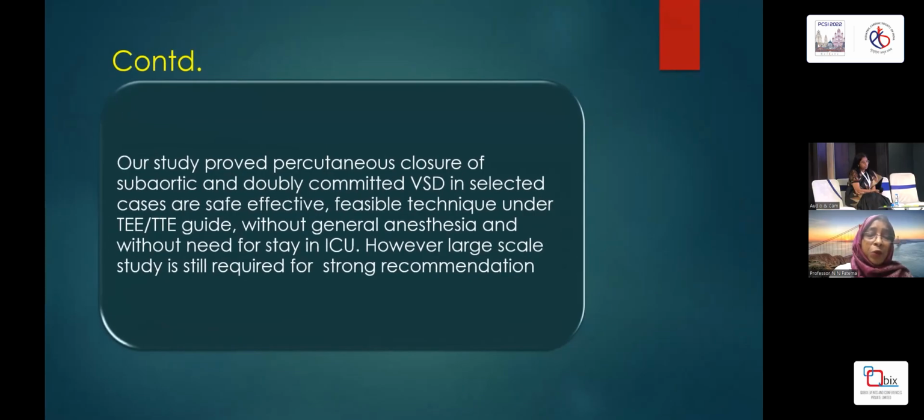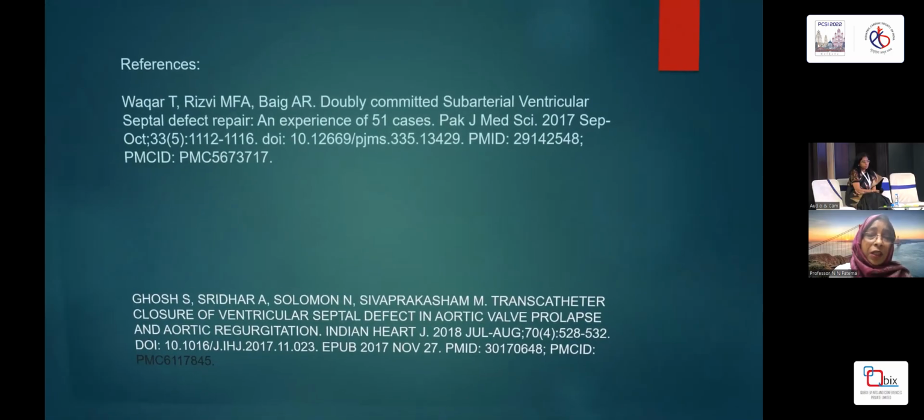So our study proved that percutaneous closure of subaortic and doubly committed VSD in selected cases is a safe, effective, feasible technique under transthoracic echo guidance, even without general anesthesia and without need for stay in the ICU. However, large-scale studies are still required for long-term and strong recommendation.